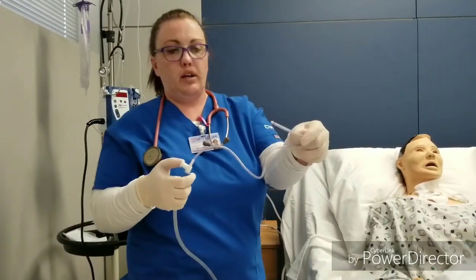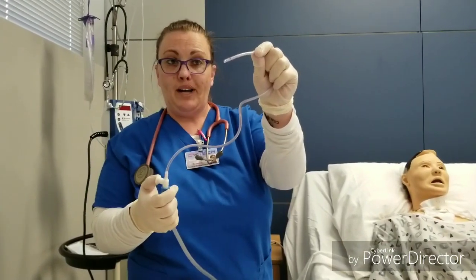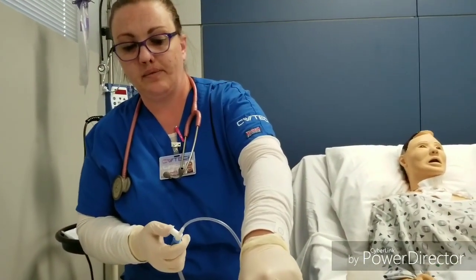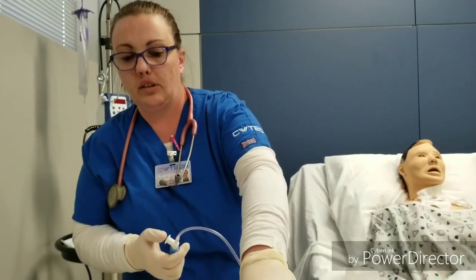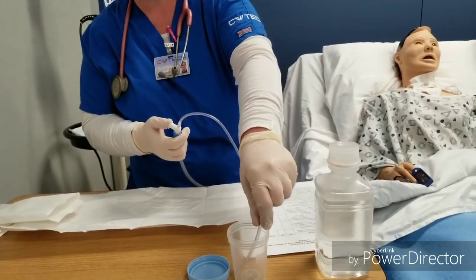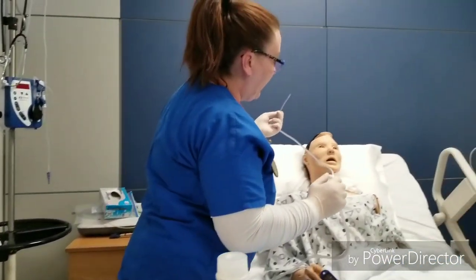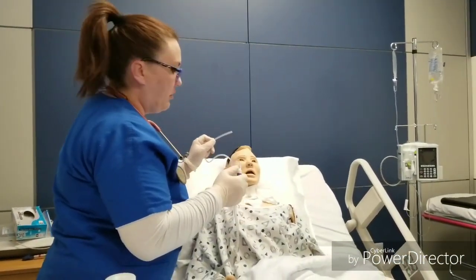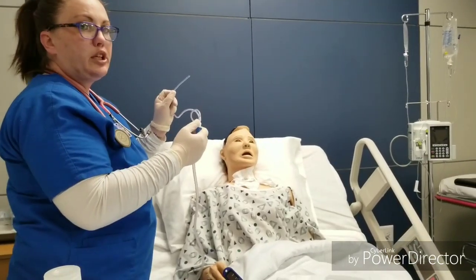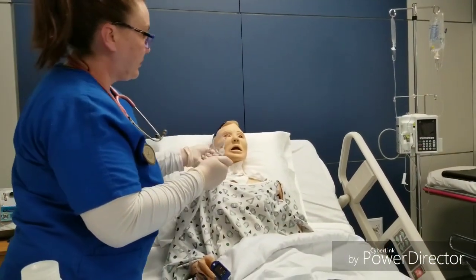So I'm going to moisten and check my suction with the saline, and you're going to hear the water sucking up in there if your suction is working properly. Alright, now we're going to go in one side, and remember when you are going in, you are not suctioning as going in, so make sure your thumb is off the suction. Keep it to the side.